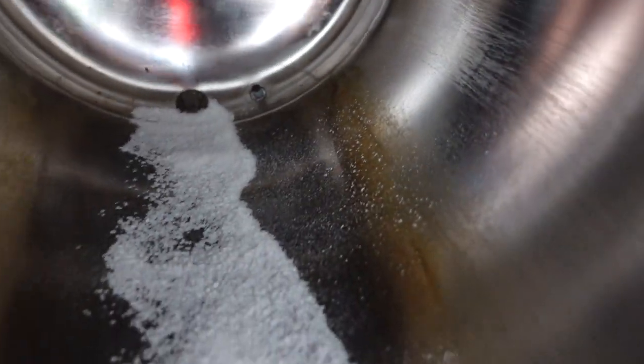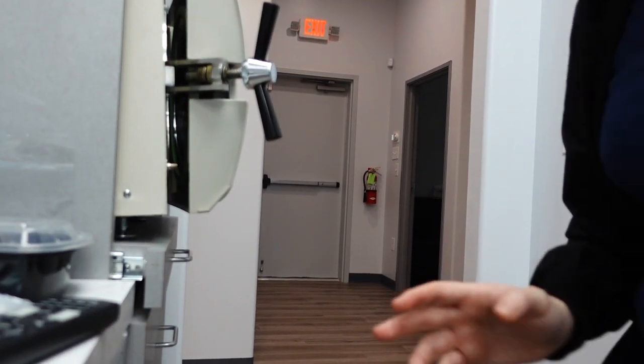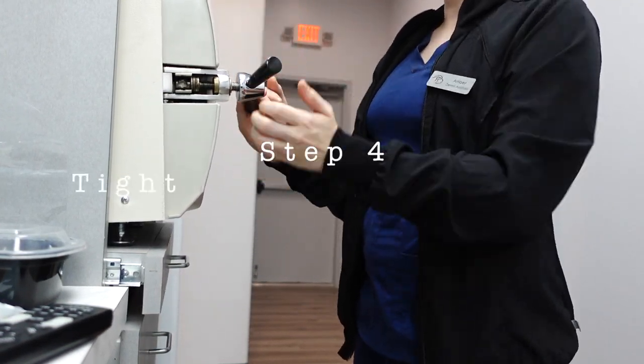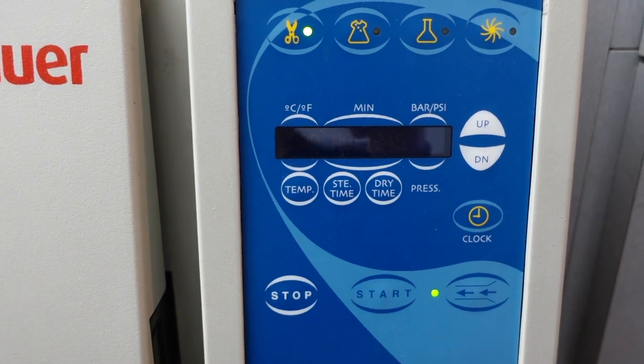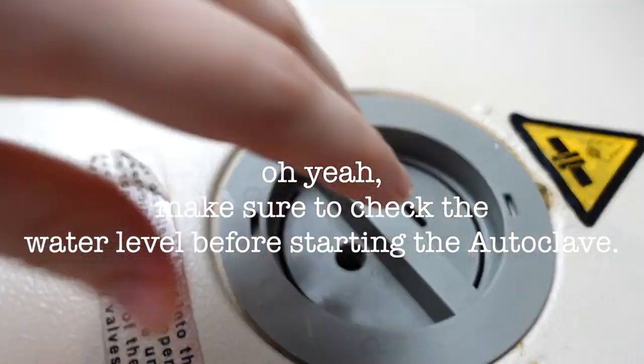You see how dirty she is? She should be clean instead of brown and black. Make sure she's nice and tight. You come over here and press stop. Let that run. I'll do three total cycles.